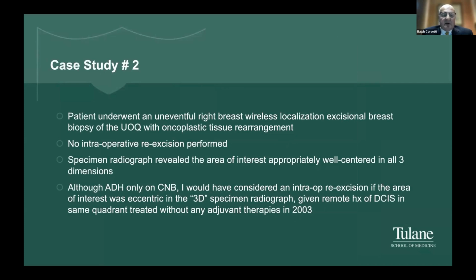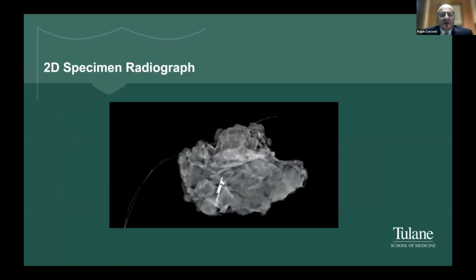And although there was no invasive disease or DCIS on the original biopsy, given the history of her DCIS, I certainly would have contemplated shave re-excisions if I felt my specimen was eccentric. So here is the specimen. And here's the video on this one.